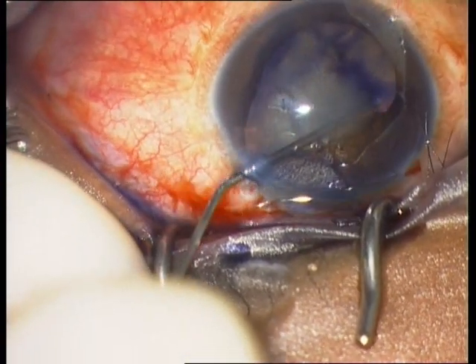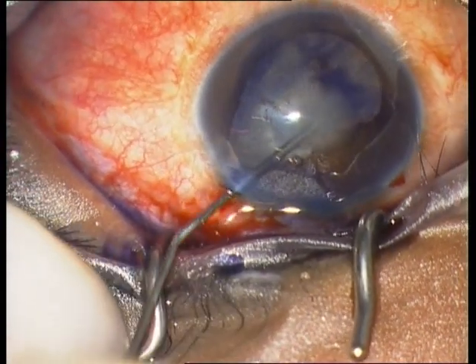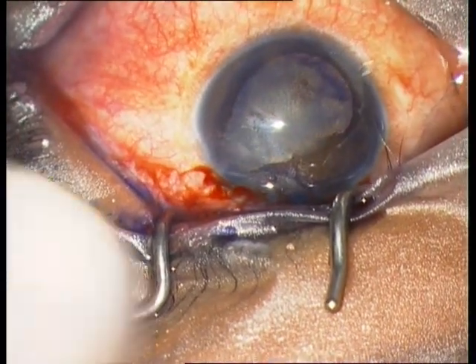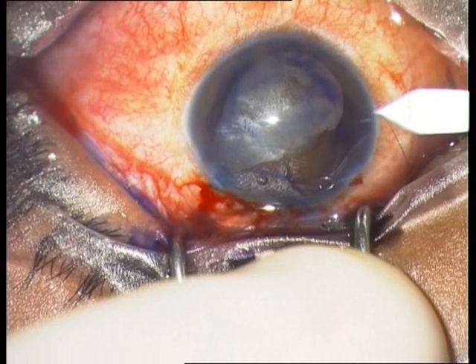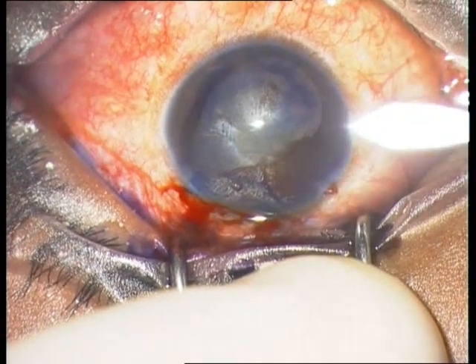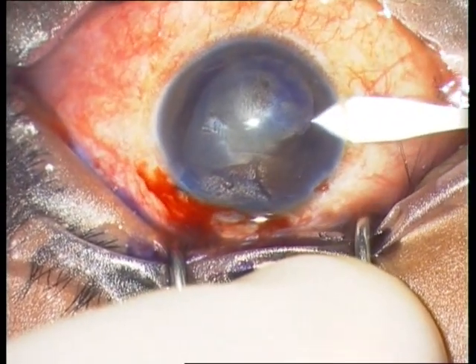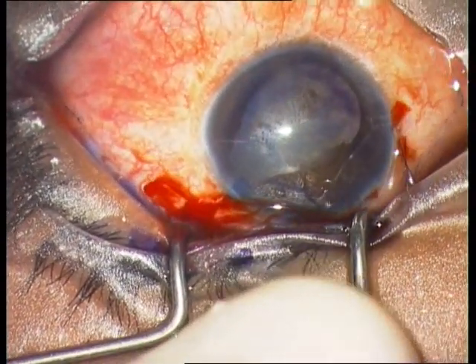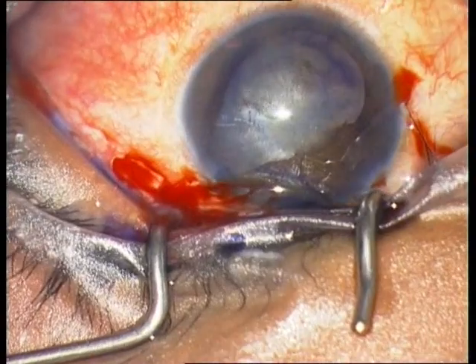Then start with the rhexis. Important here is first to remove the posterior synechia, which you can see from 10 o'clock to 2 o'clock. Main incision at 9 o'clock.